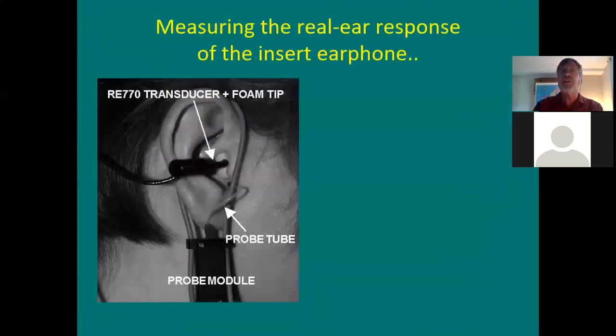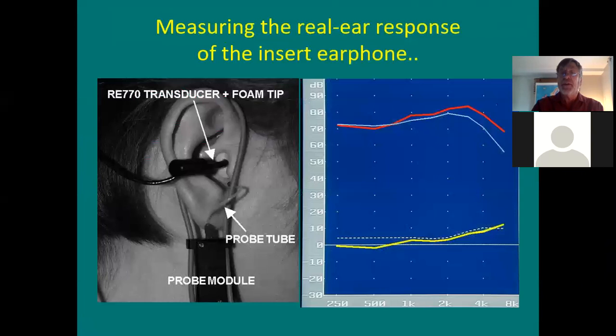So measuring the real ear response of the insert headphone, there's a third picture of it. So here, if you actually measured someone's RECD, it might be a little bit different from average. Look at that. In this case, it's the yellow. Okay, so you may not get the average RECD. You might get a little bit different.